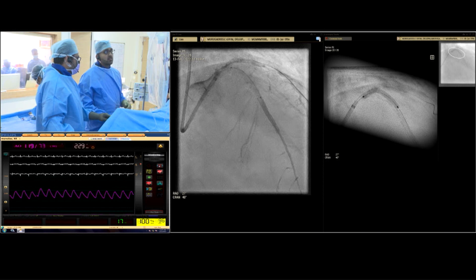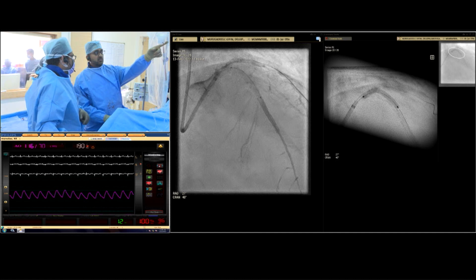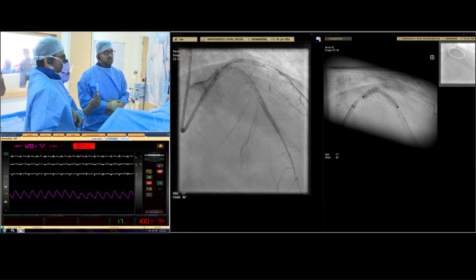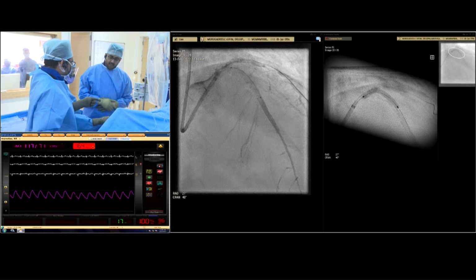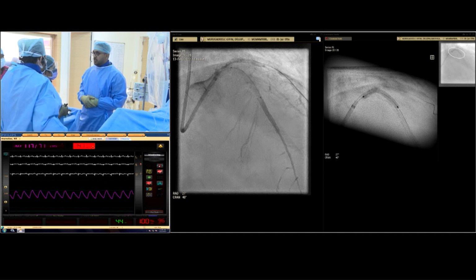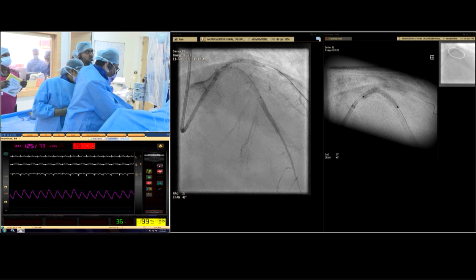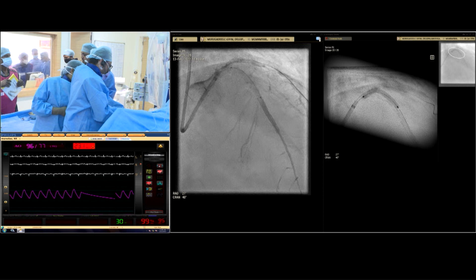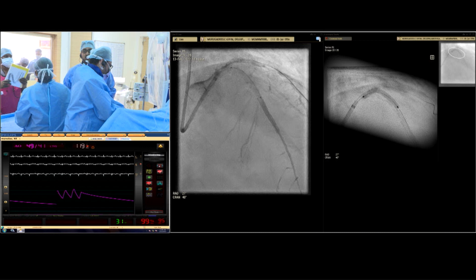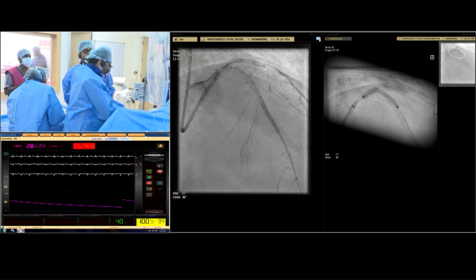34, this is 22, depending on the overlap. 2 millimeter here. 22, 28, standard 32. We need to come up to the left main ostium. 34. I think the 34 will be too long. 32. Is that dilating the ostium? I don't want to cover the ostium of the left main because that looked normal, sir, on the OCT. Then, okay, if you're not catching the ostium, then I think 32 also.